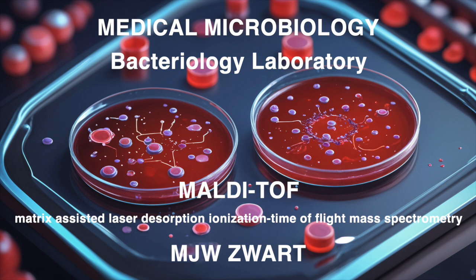Right. It's like this delicate dance between speed and precision to get those samples just right. Exactly. You've got to be quick, but you've also got to be careful. Those proteins are delicate little things. So once you have those samples all prepped and ready, what happens next? Then you load that target plate, the one with the samples, into the Microflex for measurement.